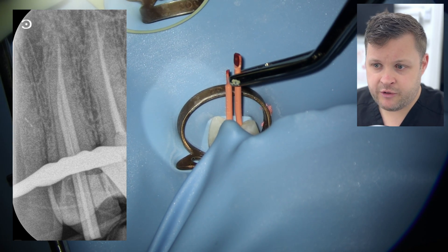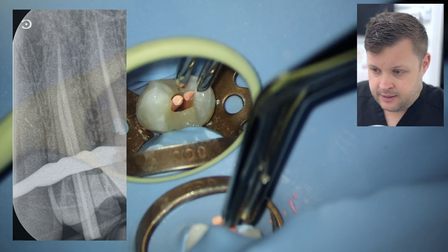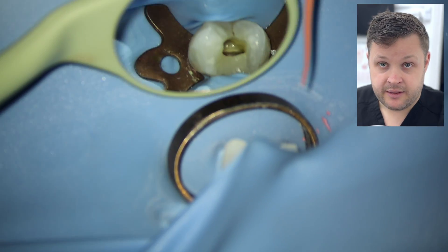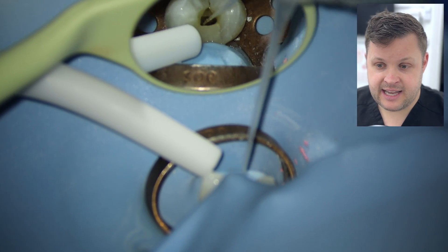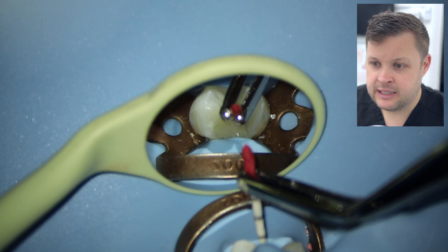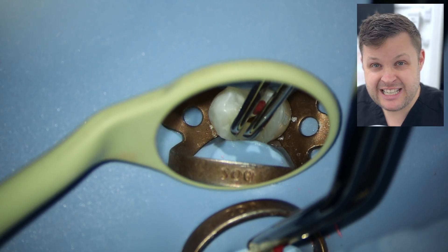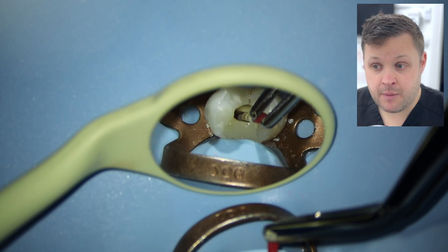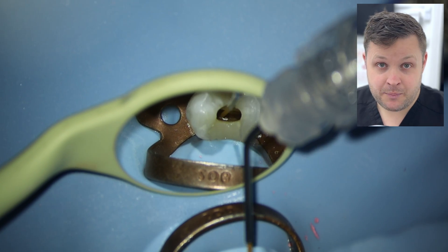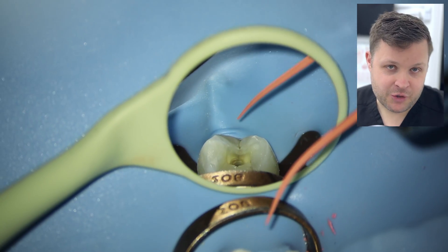The cone-fit radiograph looks beautiful — nicely shaped GP to length. I'm really excited to see the final result. Removing the GP points, when you pull GP from a canal joined to another you can sometimes get a concertinaed look, but in this case it hasn't. Then more sodium hypochlorite and EDTA to remove the smear layer and open up lateral canals. Drying the canals nicely with paper points — I'm using WaveOne Gold paper points from the packs. Then proceeding to obturation using a warm fill with bioceramic sealer.